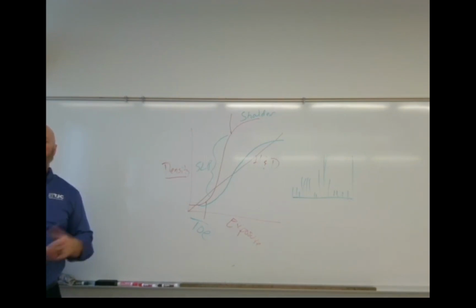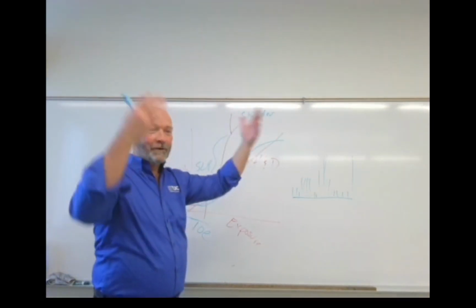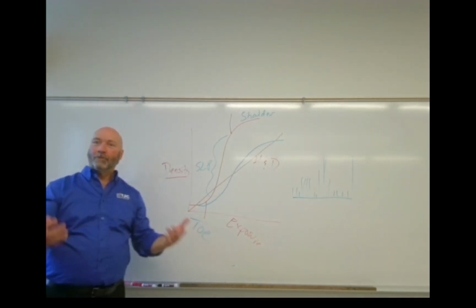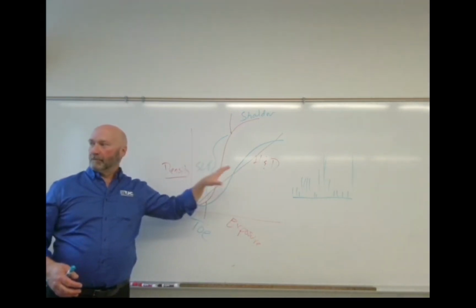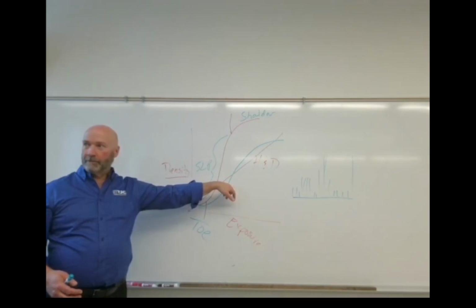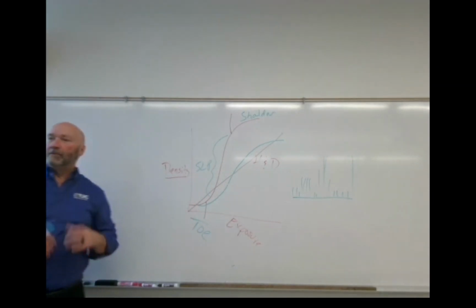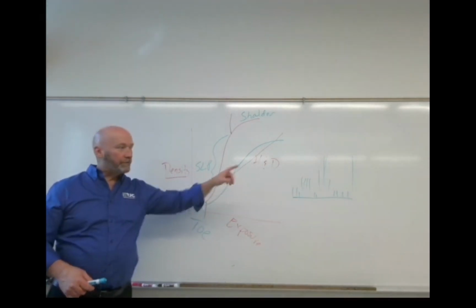Yeah. I ended that kind of on a high inflection, like I was looking for a question. It was really a statement. Your contrast is going to be determined by essentially what button you push. Chest x-ray for ribs, or chest x-ray for chest x-ray versus chest x-ray for hand. Your contrast is going to be controlled by that. And these are just visuals for that.